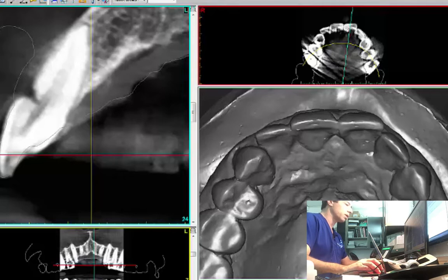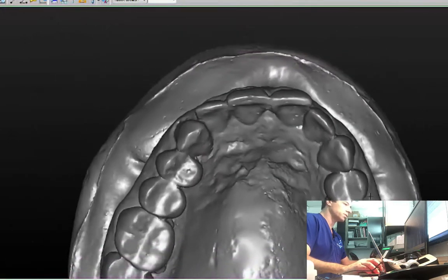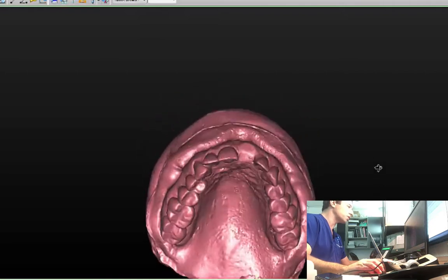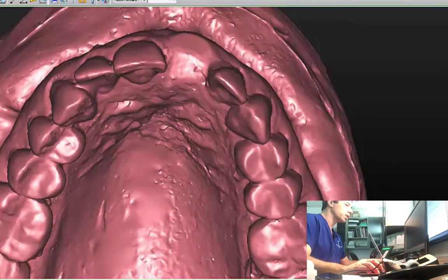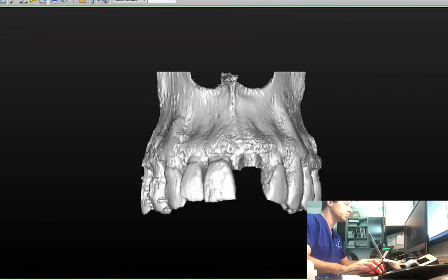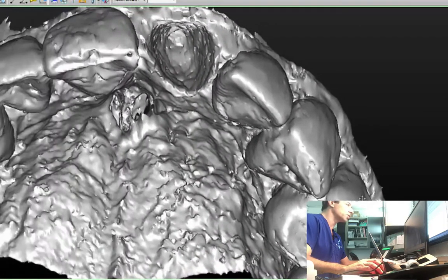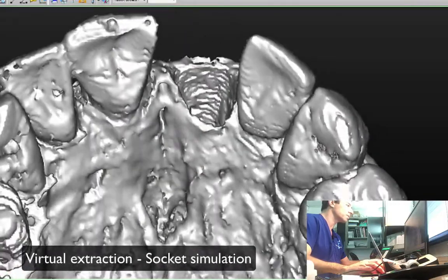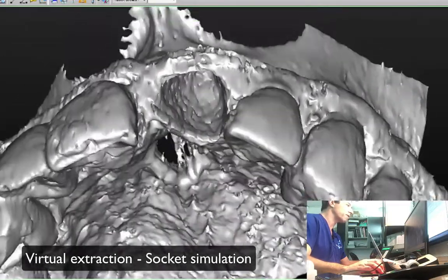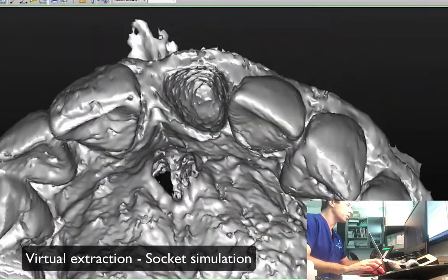So the other thing I have is a virtual extraction of the tooth, and I also had a virtual extraction from the socket, so you can actually tell where the socket is. You see the socket? We have pretty good bone on the palate.